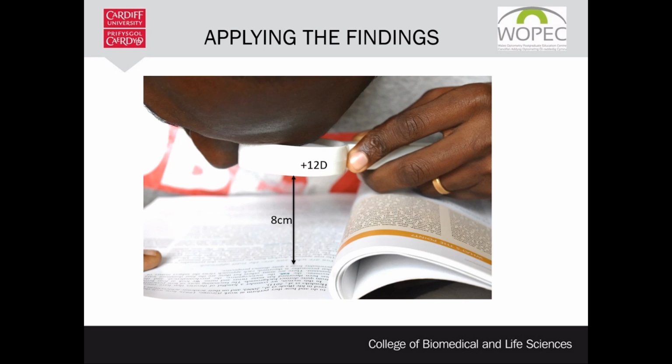The appropriate place to have the best view with your magnifier is to place the target at its anterior focal point. If you do that, to determine this distance, all you do is find the reciprocal value of the power of the lens. That would be 1 divided by 12 diopters, which gives us 0.08 meters, equivalent to 8 centimeters. Our client will therefore use a 12 diopter magnifier and will need to use it at 8 centimeters.